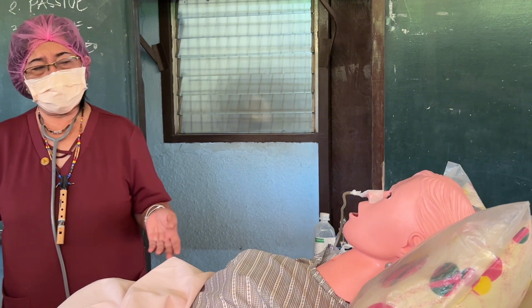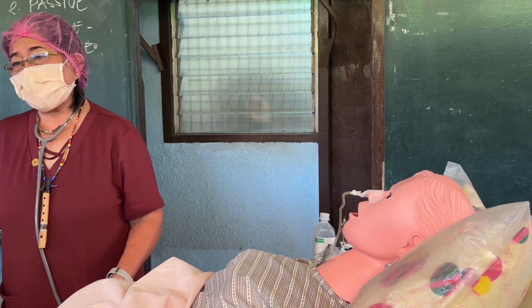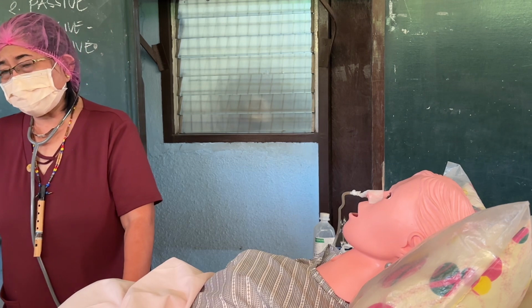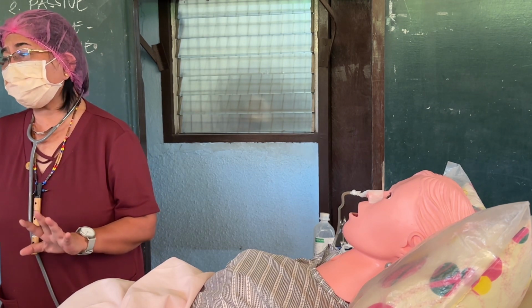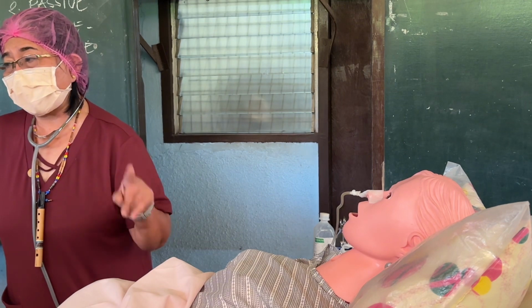Okay, the volume, also the volume. And then the reaction of the patient. And of course, if you did the 5 ways to check for confirmation that the tube is still in the stomach.